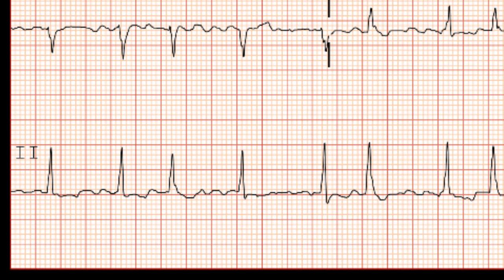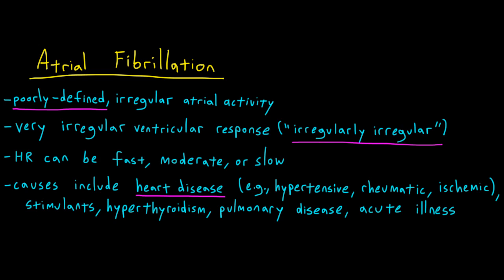This is an example of an EKG of a patient with atrial fibrillation. Atrial fibrillation is characterized by poorly defined irregular atrial activity and a very irregular ventricular response. We sometimes call it irregularly irregular. The heart rate can be fast, moderate, or slow. And there's a number of things that can predispose patients to developing AFib. Because the focus of this video is to go over a basic method of reading EKGs, we'll go in more detail about AFib and other arrhythmias later.